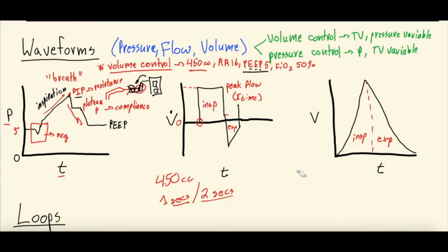So this is the introduction to the waveforms in volume control with some shout outs to the pressure control changes, different parts of the waveform, what they mean, and future video, which we'll end up putting in this video's description once it comes out.